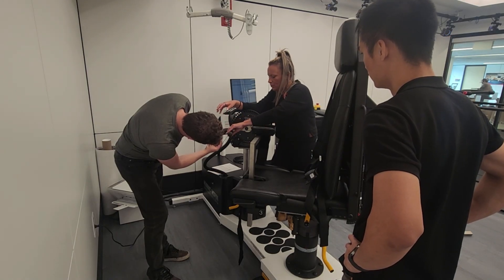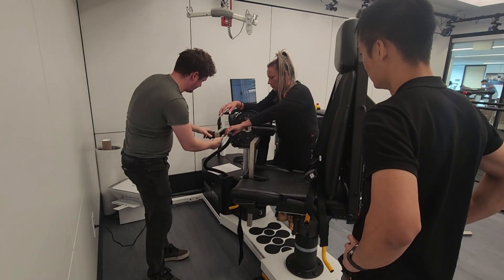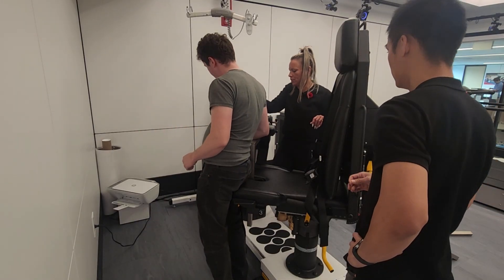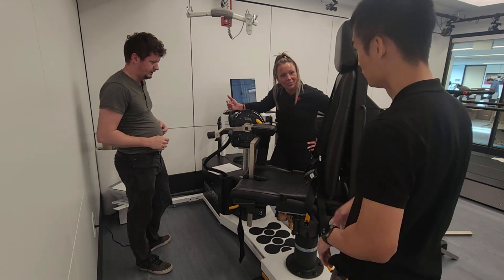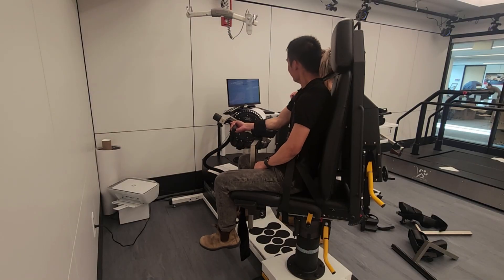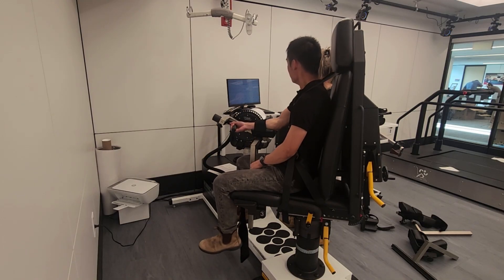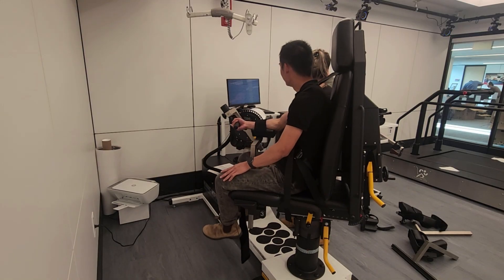Probably flip it all the way around. What's the opposite of 113? Now it's 113 — okay, perfect. That was right because your thumb was against it and you liked that. So now sit down and go — in you get. That'll be a full set. All the way for one. Then go all the way — there's one, it counted. Go, all the way up — yes. All the way down — there's two. You've got three to go. All the way up, all the way down.